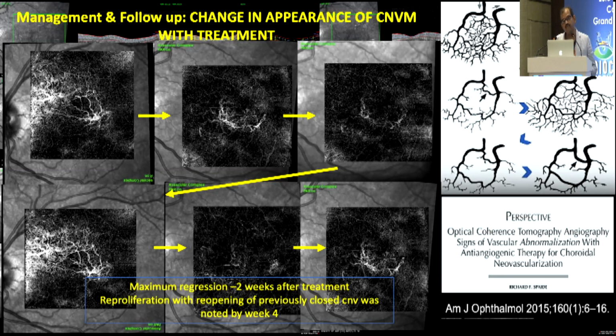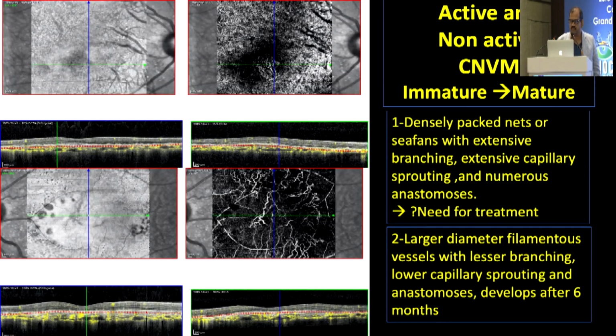Till now we are managing all our choroidal neovascular membrane patients, neovascular AMD patients, by assessing the fluid. We are not using the biomarkers of OCT angiography for managing these patients. But these things will come up as our understanding of OCT angiography develops.